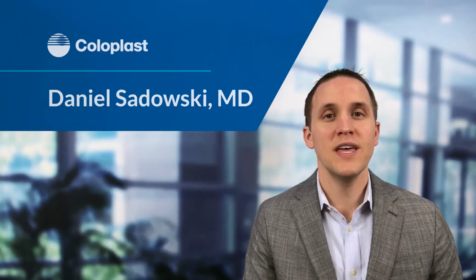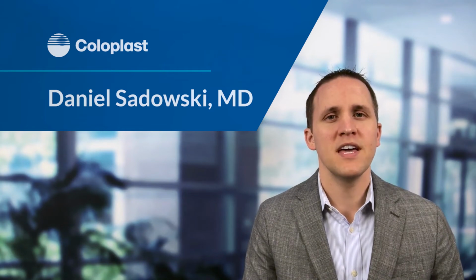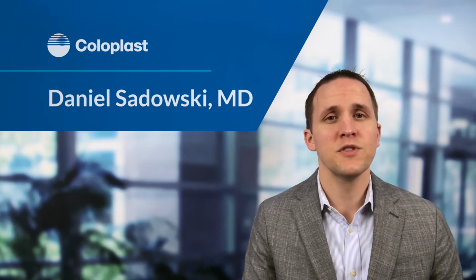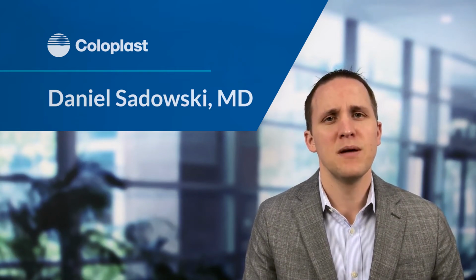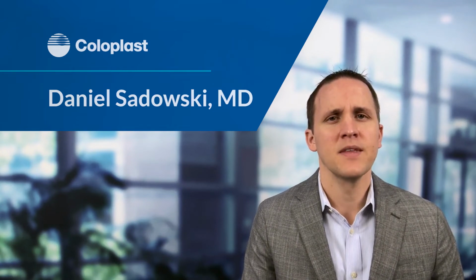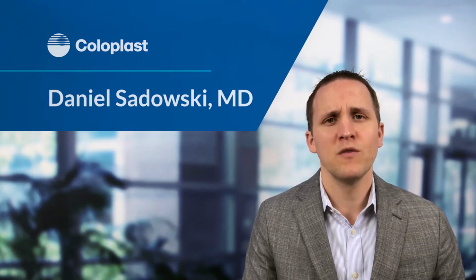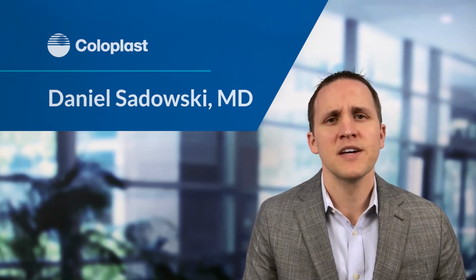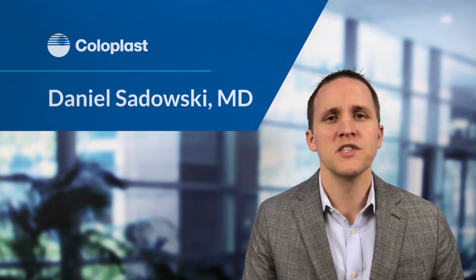In order to implant the device, we make an incision on the scrotum just beneath the penis. And from that one incision, we're able to put the cylinders into the penis, the pump into the scrotum, and the reservoir into the belly. Now, if you've had a prior pelvic surgery or treatment for prostate cancer, I may need to make a separate incision in order to place that reservoir.